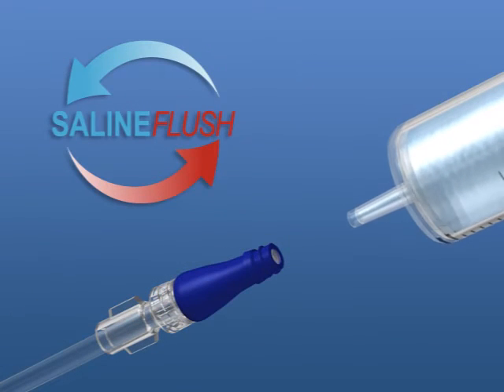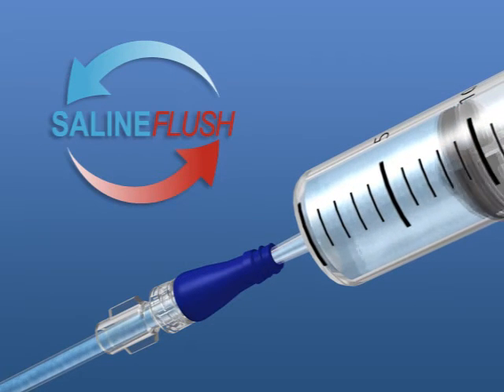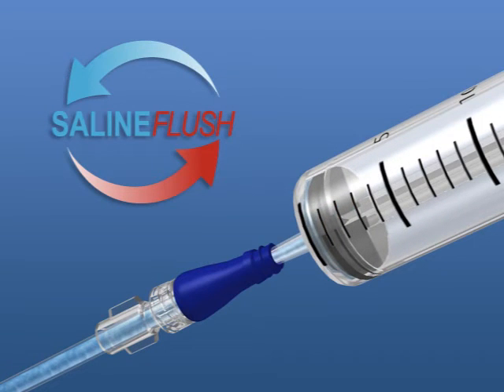The Microclave also incorporates a saline flush protocol, which provides cost savings to the health care provider and eliminates the risk of any clinical complications associated with heparin.